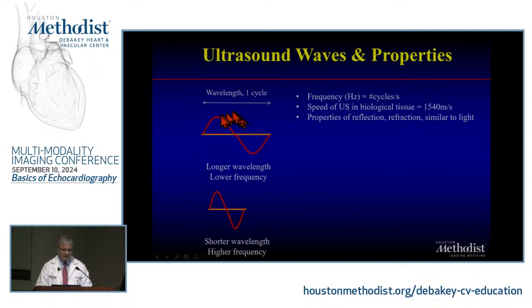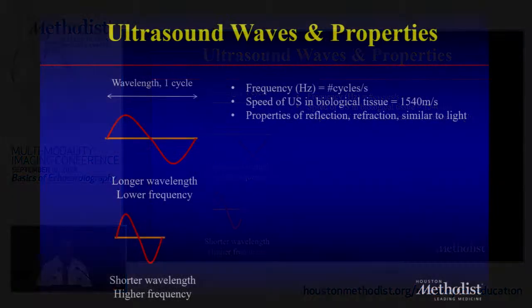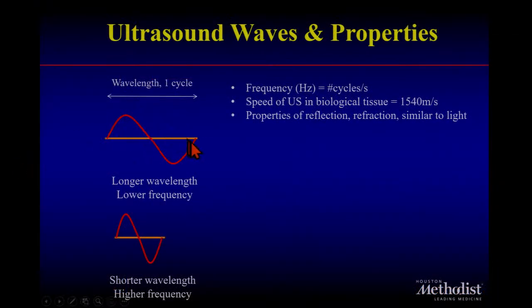The frequency is how many cycles of this wavelength occur per second, right? So if you're talking about 3 megahertz, these are 3 mega of these waves over seconds.